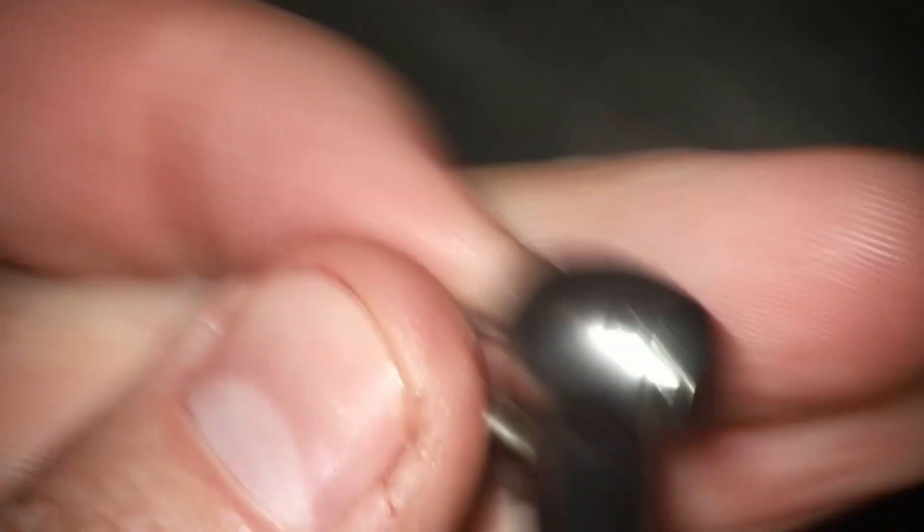Screw that cap back on, test fit it back on the adapter, press the pedal, make sure everything runs and spins, and you should be ready. For the cost of about $30 to $40 and about three minutes of your time, you've saved what is, on average, a $300 repair.